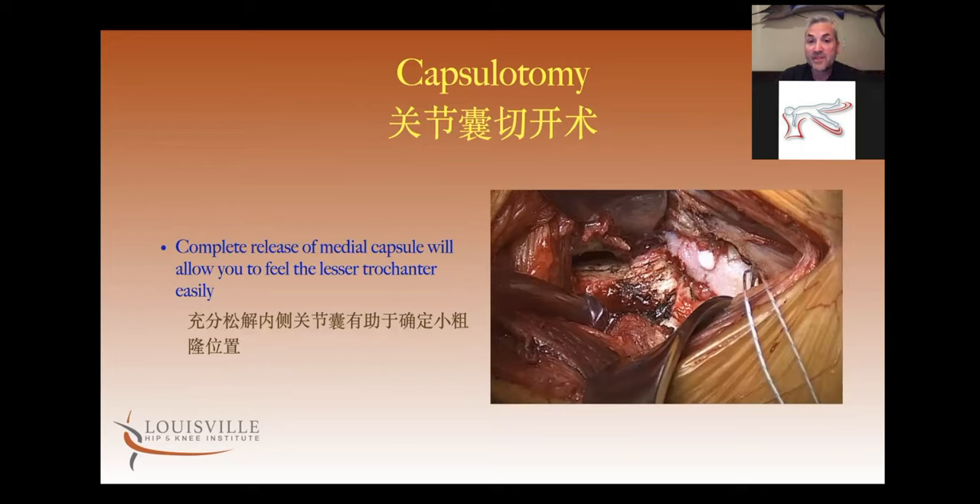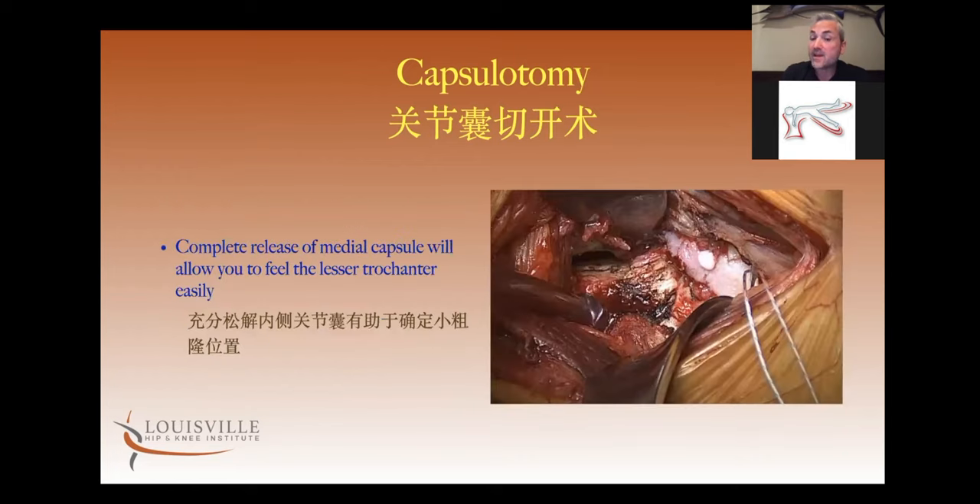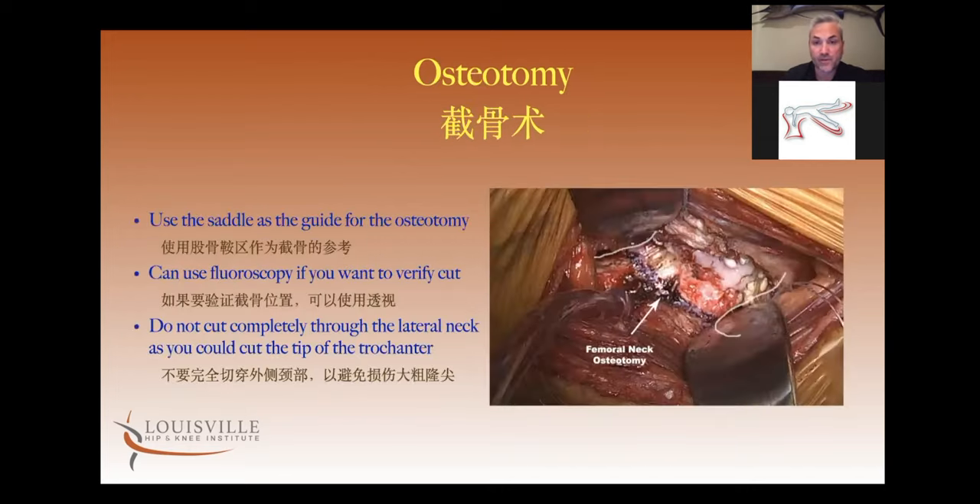This is what you should see when the capsule is completely released: an empty black space where before the capsule was adherent. The fingers should go over easily to feel the lesser trochanter. For the osteotomy of the femoral neck, I use the saddle as my guide. You can also use the lesser trochanter — one finger breadth above the lesser trochanter, or whatever your preoperative template calls for. You can always bring in fluoroscopy as well to double-check.